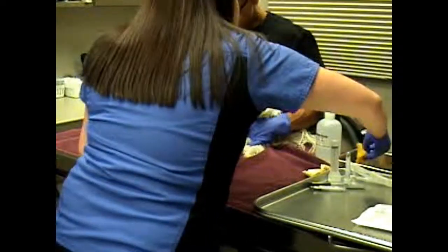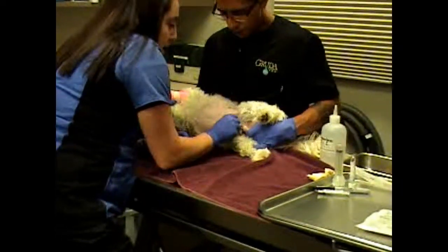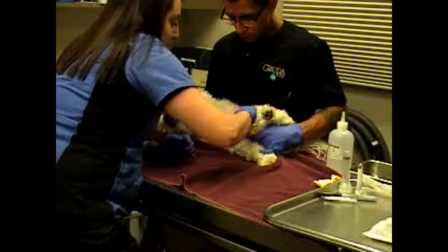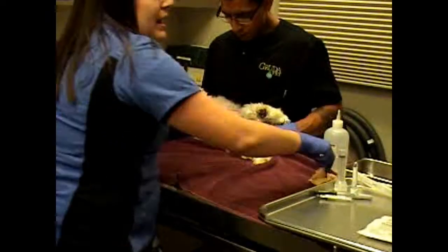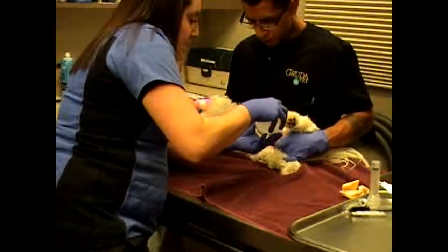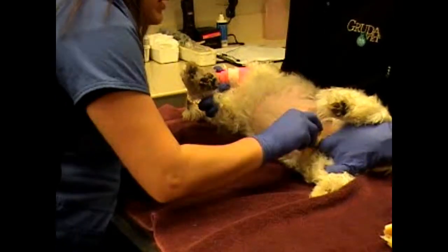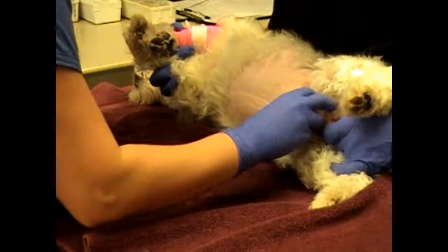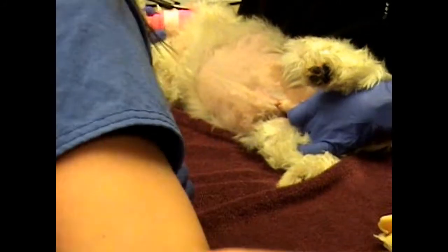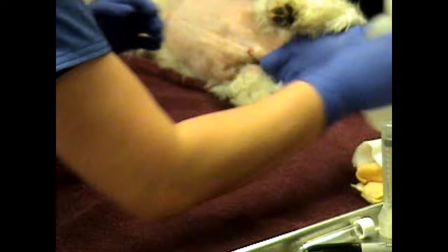Come back in with betadine. And I'm also just kind of trying to wipe away or push back the hair around that area. That way it's not in the way when we actually put that catheter in, because that again can be a source of bacteria. So just rinsing again with sodium chloride. And then last but not least, a little rinse again with betadine. And I'm just going to push back all of that hair.